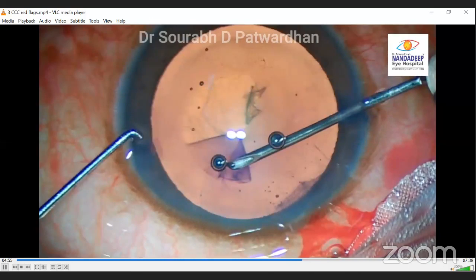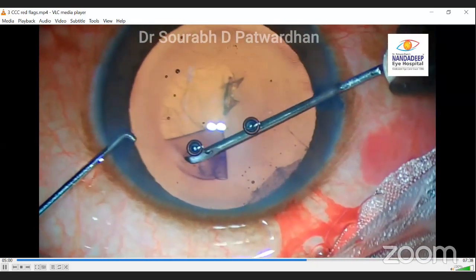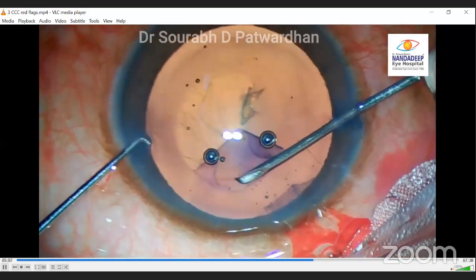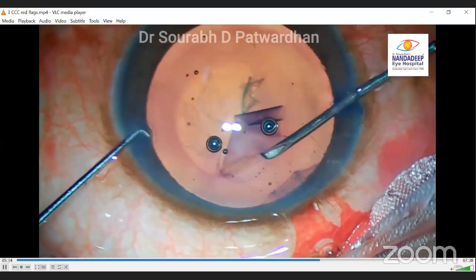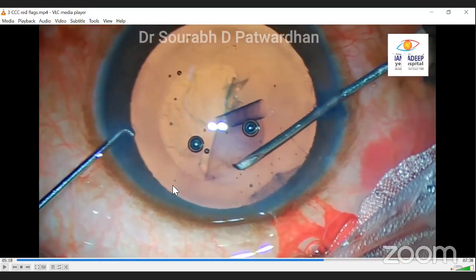Now again, another very careful trainee surgeon is doing his rhexis. He is fully focusing on the Capsulorhexis margin here, proceeding very slowly to continue with the CCC. And what is he missing here? Can anybody tell me what is he missing here? What are the problems, or what are the things which he is not looking at?